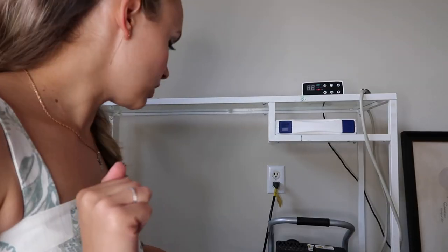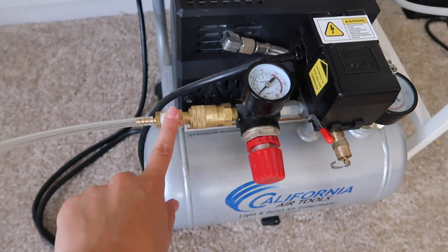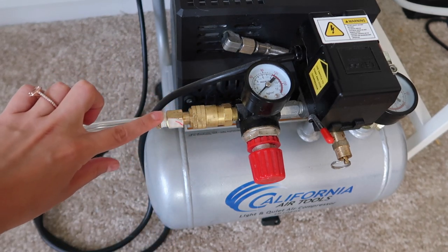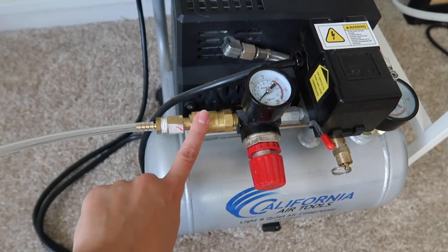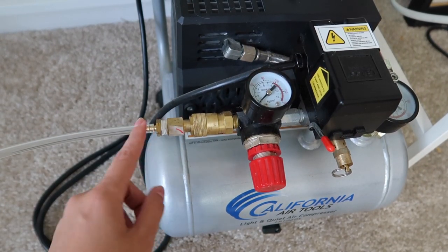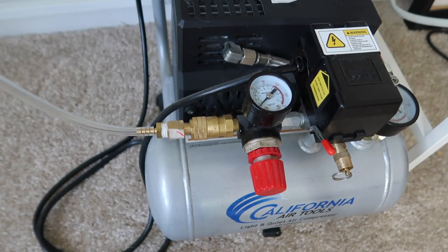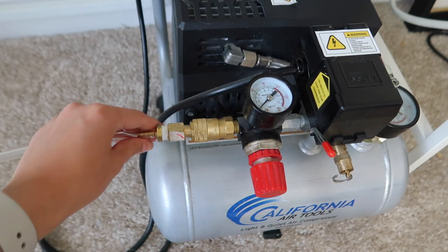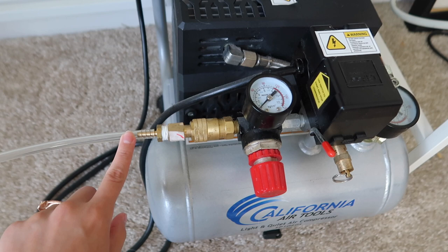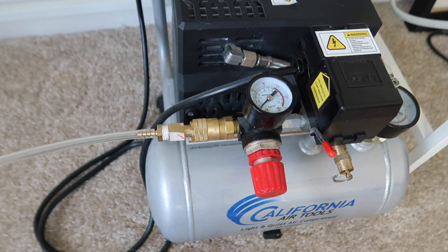Step two is to connect the brass thing to the compressor. This tiny little piece is the brass barb that was missing. You connect it to the golden part on the compressor — same color — and just push it right in. Then take the tube you just connected to the dental unit and push the tube into the side part of that brass barb.